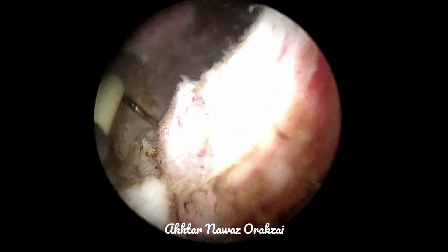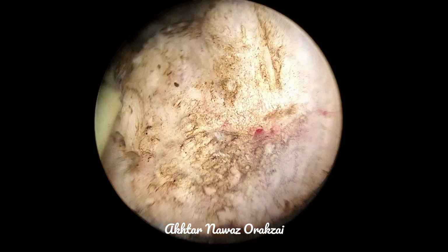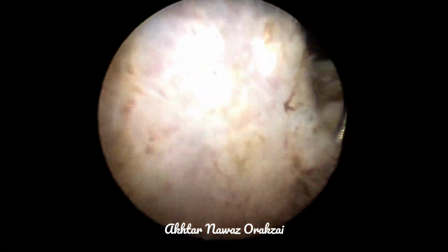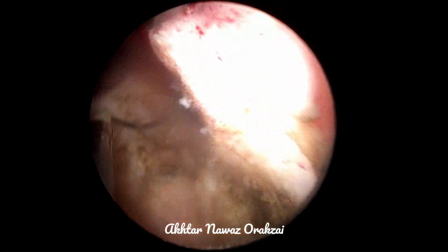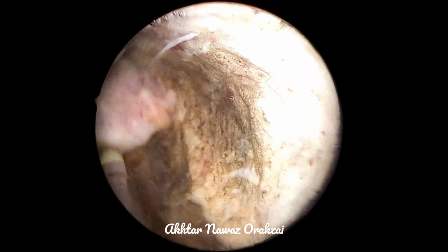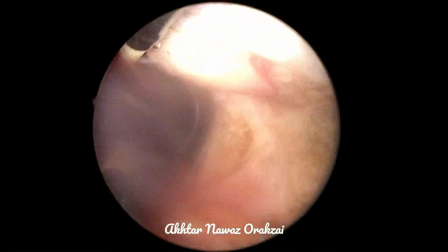Because if 2 or 3 such brisk bleeders combine, they can really hamper the vision, and the beginner may get a little anxious, so the procedure will become quite difficult. Here you can see that I'm pushing each and every chip into the bladder.